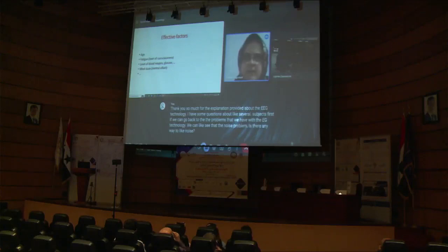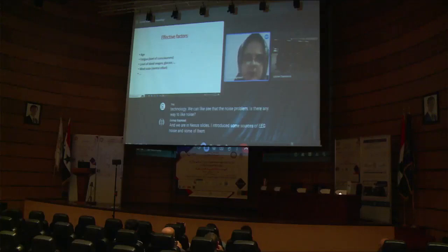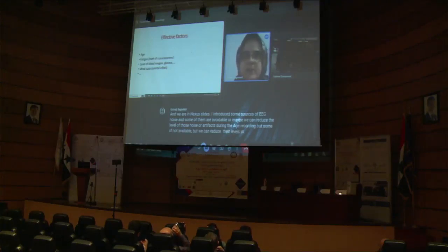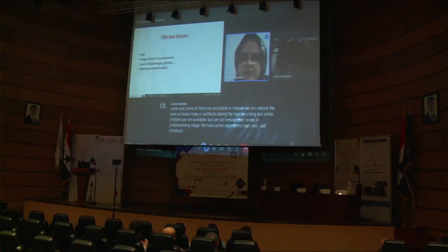In the next slides, I introduced some sources of EEG noise. Some of them are avoidable, or maybe we can reduce the level of those noise or artifacts during the EEG recording, but some of them are not avoidable, but we can reduce their levels in the pre-processing stage. We have some algorithms that I will introduce in this workshop for reducing the level of noise or artifact.